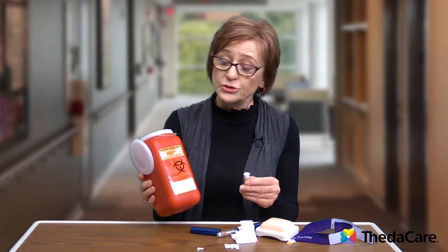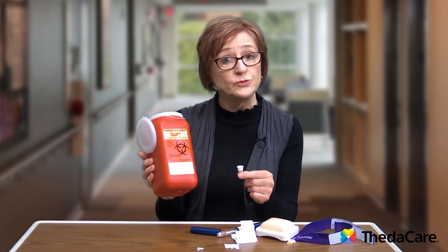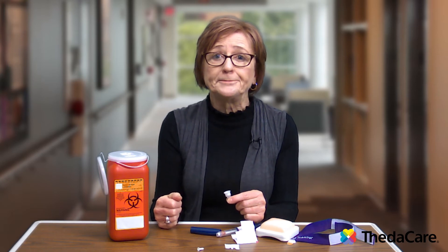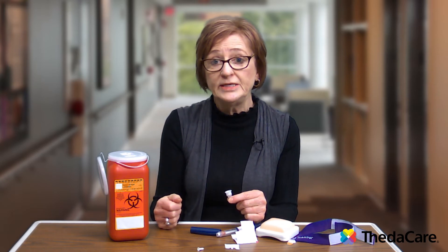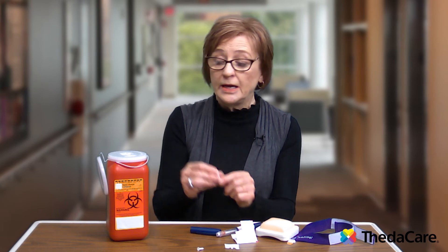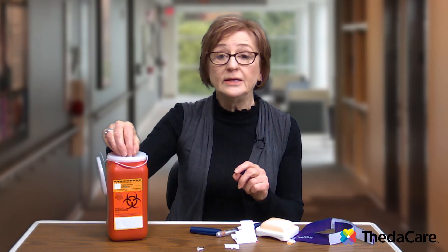You can purchase sharps containers at most local pharmacies or drug stores. But you can also make your own using a heavy plastic detergent bottle or bleach bottle with a screw cap — label it 'sharps' and place the sharp into the container. There are also certain sharps disposal stations that you can take the container to once it's filled.